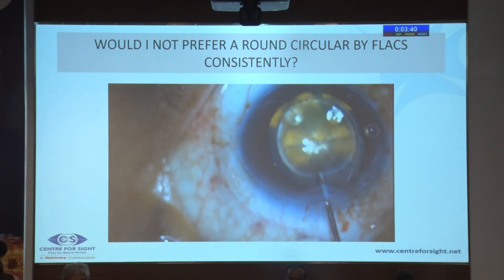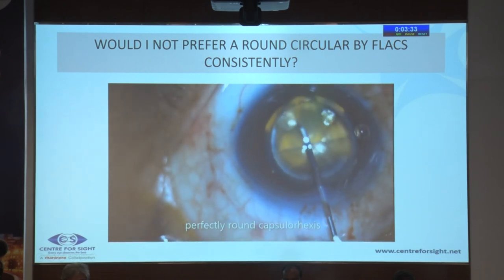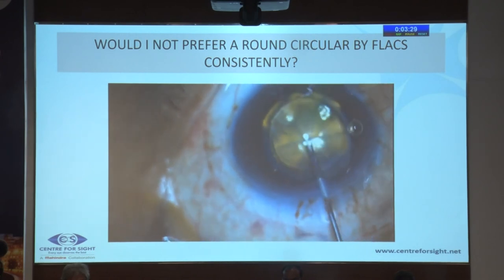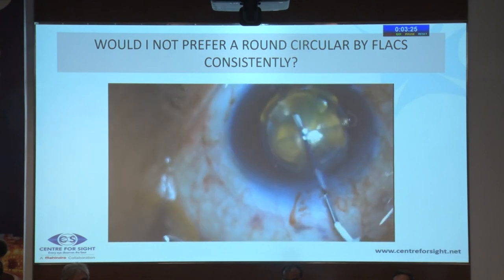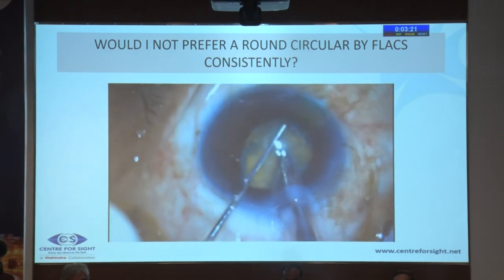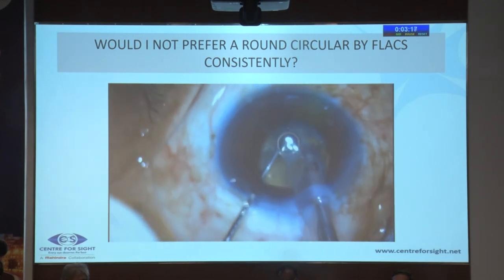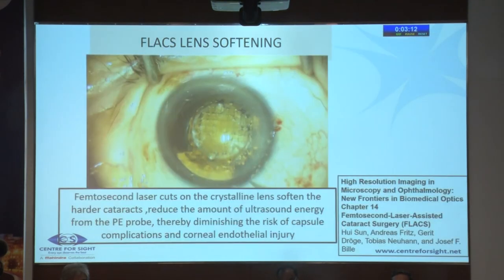So this is, again, a very small thing. I always feel, why not have a wonderful rhexis? Because half your battle is won. Once you do the rhexis, whatever method you want to do, you've got a very hard cataract, and therefore you can do sculpting, and once you do one sculpting and break one piece, after that you go ahead and do your chopping, and the pieces of pizza just separate out, and how comfortable that is for you.